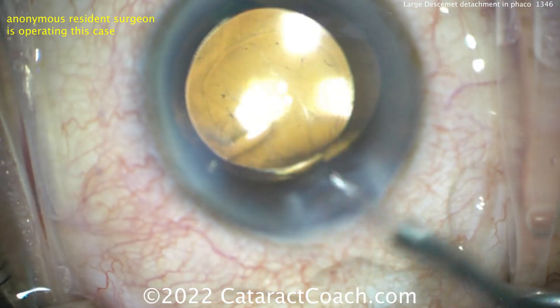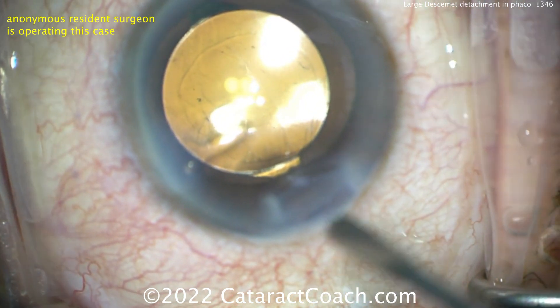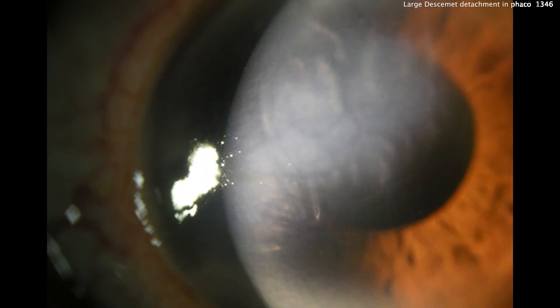There's a chance those endothelial cells could migrate and it could be okay. Or there's a chance you'll have to come back and do a DMEK. On the first post-op picture, the patient has a lot of corneal edema in the area where Descemet's was lost — extensive corneal edema visible at higher magnification. Maybe the cells will migrate — give it some time. But if not, in a couple of months you'll need to come back and do a DMEK.